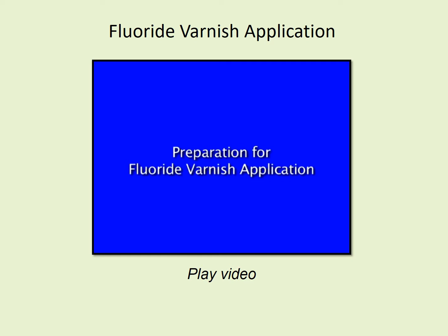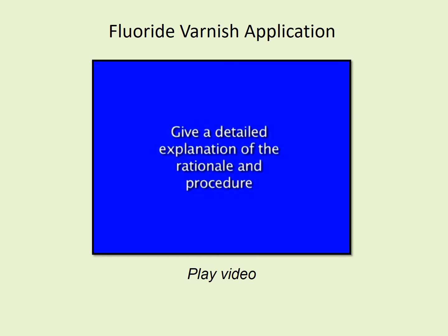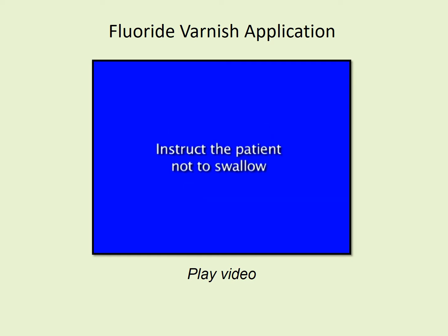Preparation of the patient for varnish application. Review the patient's medical history for any contraindications, such as food and dye allergies. Give a detailed explanation of the rationale and procedure. Instruct the patient not to swallow. Position the patient in supine position.